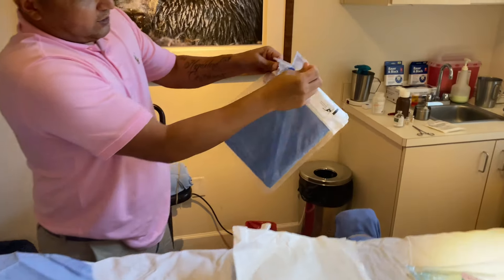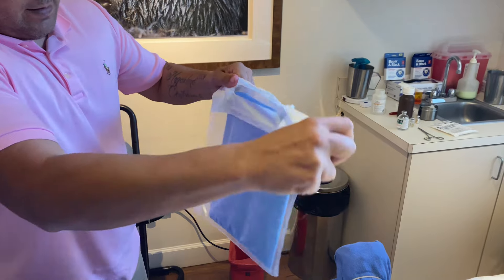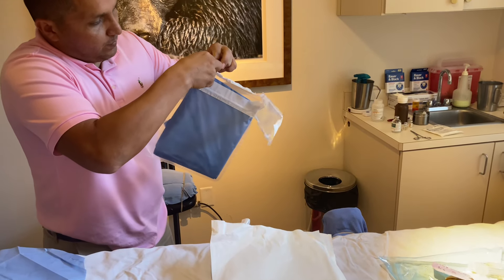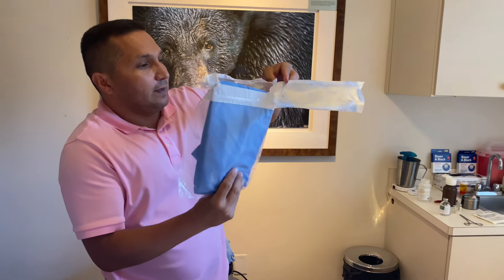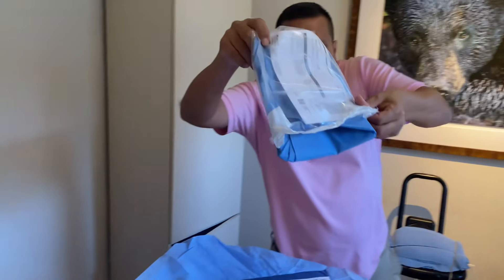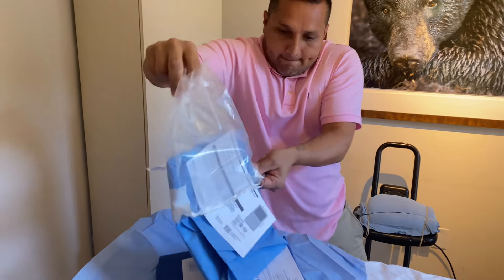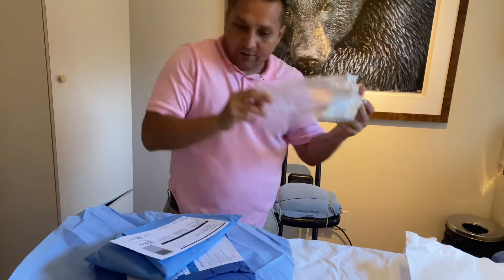This is self-explanatory — just peel it off. I'll rip off a little bit more of the sides so the disc can slide off. Everything is still in the sterile field. Just let it slide on there. This is more complicated than it looks, but there it is — still sterile.